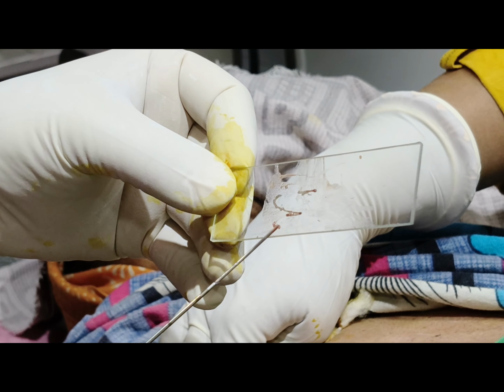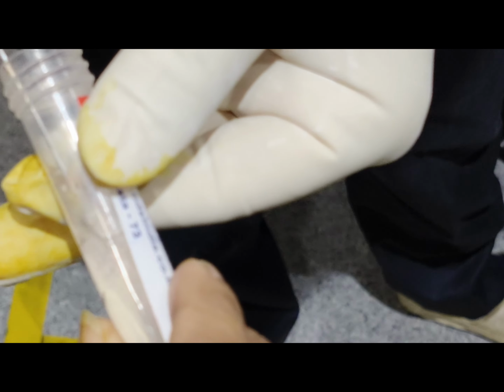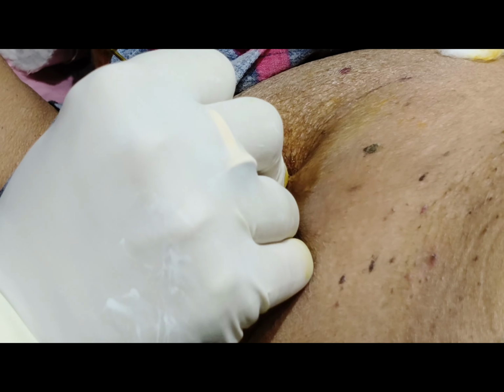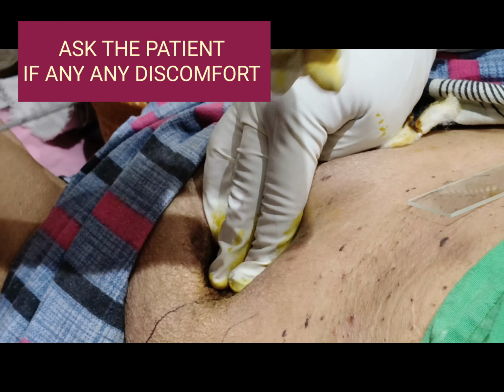So we take multiple tissues, at least 6 to 8 tissue cores, and if there is a necrotic part, we try to collect tissues from the surrounding areas, including some portion of the normal lung, so that some viable tumor at least should be there.